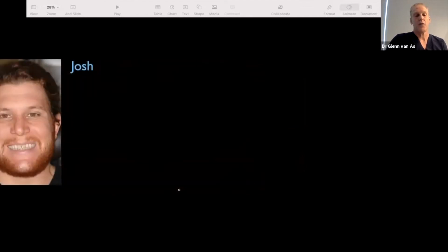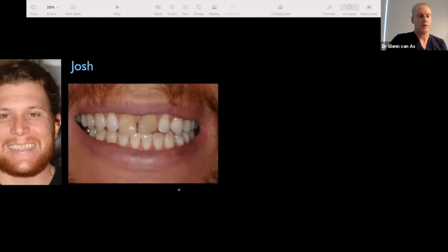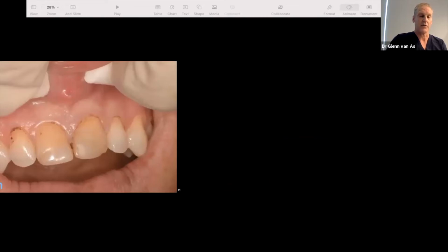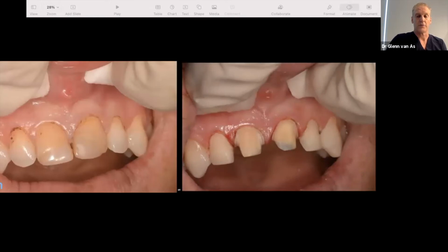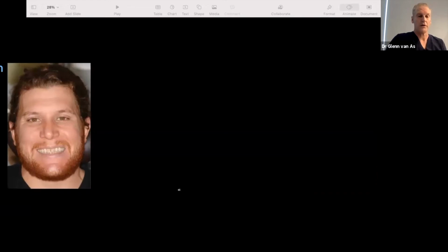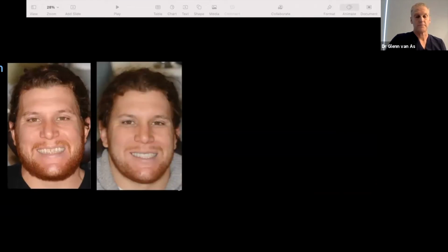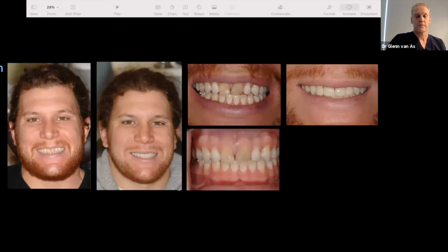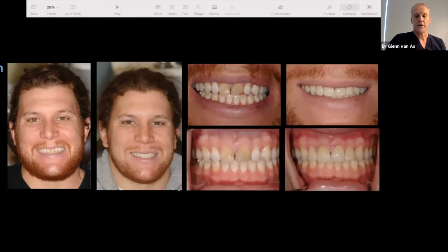So again, we see routinely cases where Josh came in, rugby player. He was actually okay with his teeth, but his new girlfriend wasn't. So off he came to sit with us, and again, we decided to do, in this particular case, a couple of crowns and a couple of veneers. We did some recontouring with the diode laser on the day of the preparation. There are the preparations, 2 crowns, 2 veneers, diode laser for troughing, provisionals in place. Here's Josh before, here's Josh after, before and after. Retracted, and after. So this is immediately post-operatively.